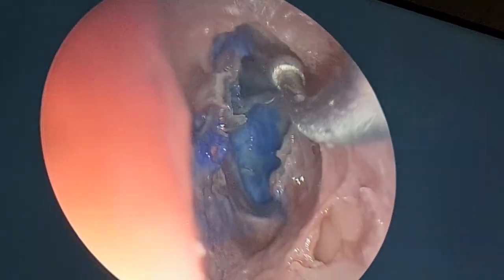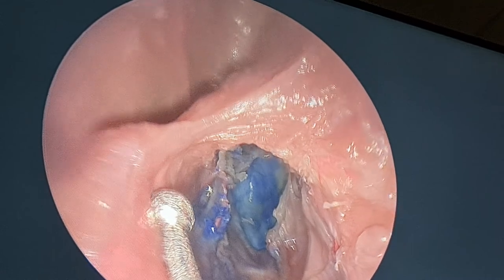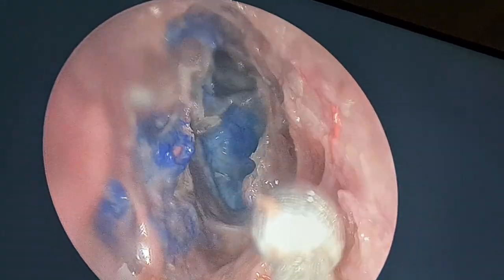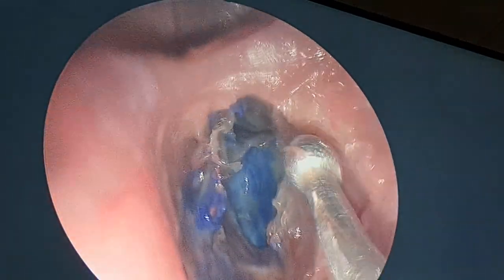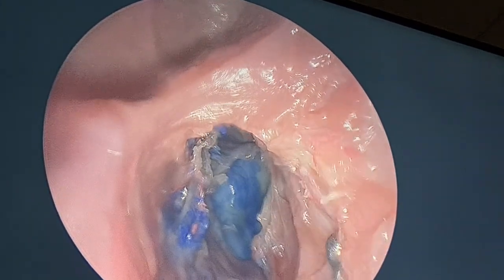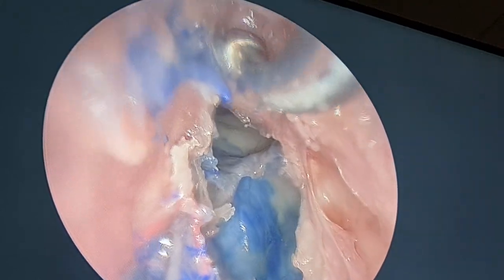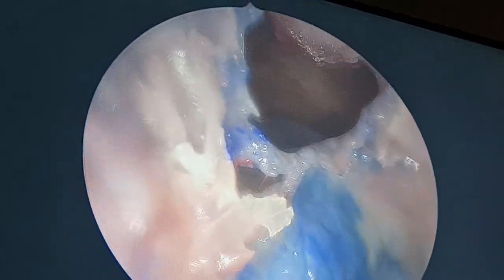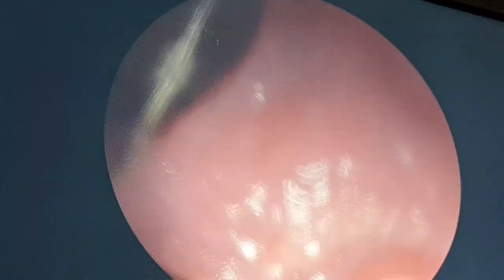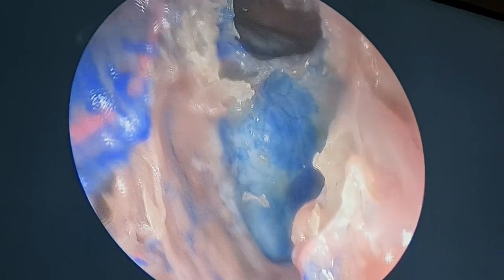You can see it even without dissecting this. Then identify the middle turbinate, you can always identify it. Remove the upper part of the uncinate, you can identify the lamina. These three things are in your view. Between the lamina and turbinate, follow the axilla in the middle. Follow the thickest bone, where it ends is the frontal sinus. It cannot change, as simple as that. And I believe each and every participant, every dissector today, will dissect the frontal sinus with the same ease.